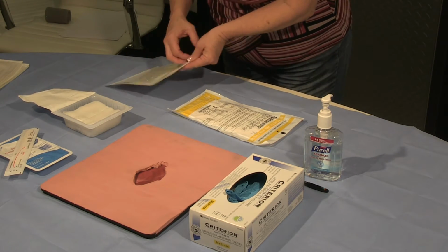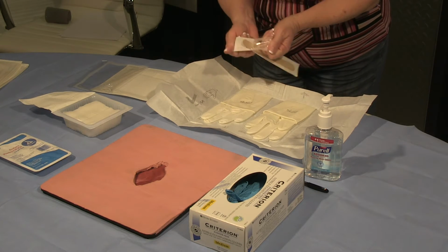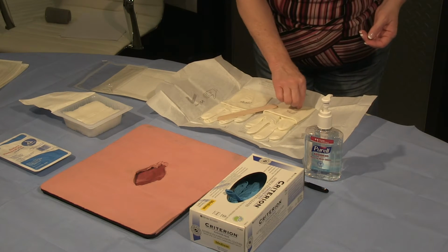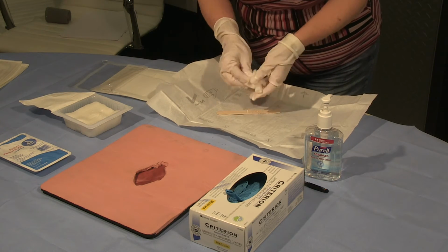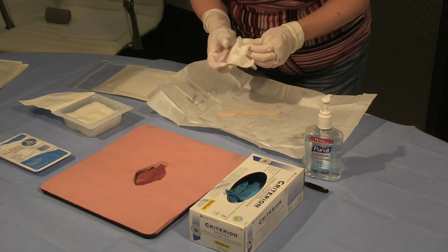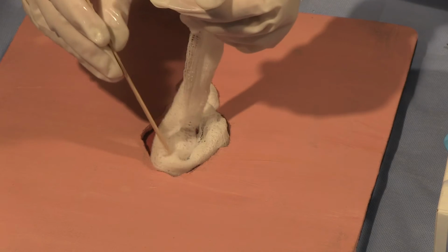Sterile gloves are opened and a sterile field is established using the wrapping from the sterile gloves. A sterile tongue depressor is opened onto the field created by the wrapper from the sterile gloves. The sterile gloves are now put on using sterile technique. One sterile, wet 4x4 is removed from the boat and unwound and layered into one hand. The sterile tongue depressor is used to place the wet 4x4 cotton gauze into the open wound.